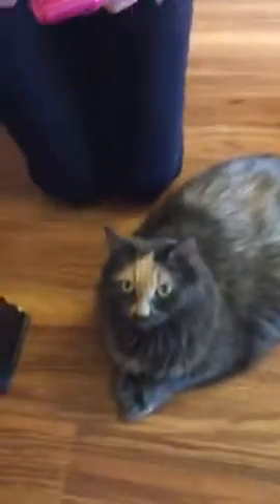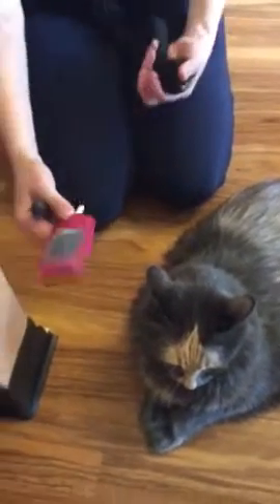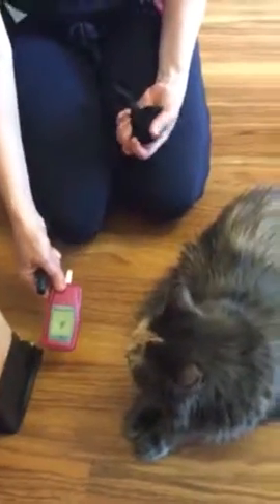I'm going to turn on the light so I can see the blood drop. Penny has dark ears, so it's hard to see the blood drop on her ear. I'll stick the strip in now because I know it won't take more than the time — and then my other cat jumped up on the condo and Penny decided to walk away. This is what happens sometimes.